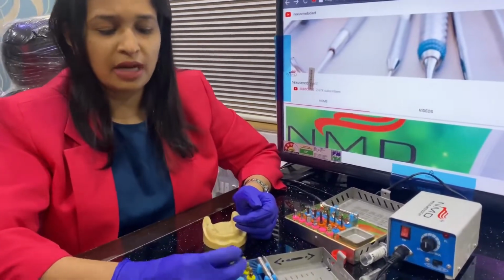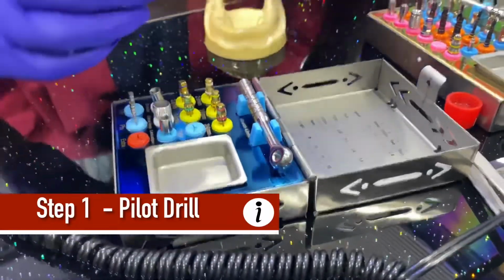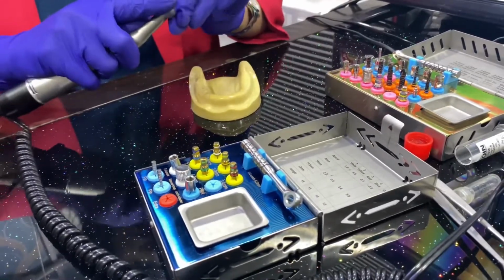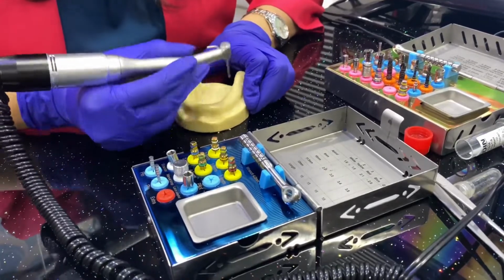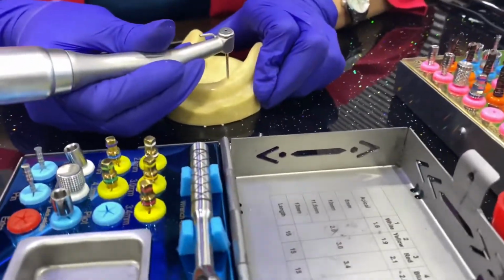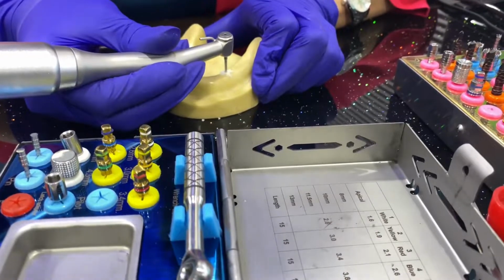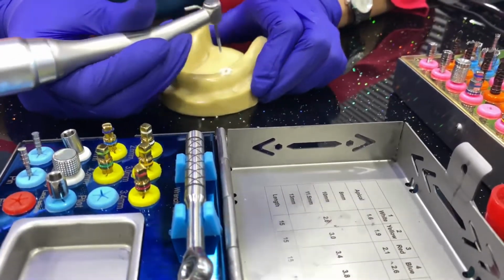So I'll be first starting with my pilot drill. It's written pilot over here. You pick up this drill. It has markings of different lengths, and you will be starting right at the center up to the desired length. If in the start you are a little stuck, you can drill up to 6-7 mm and take an X-ray also.